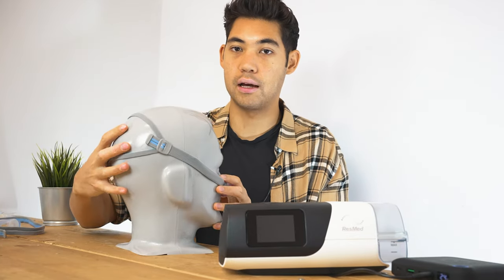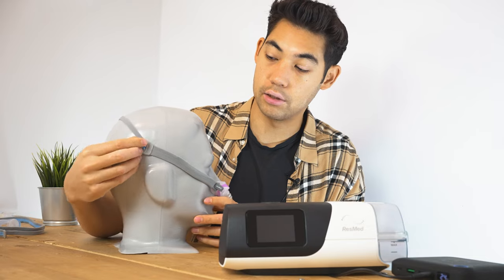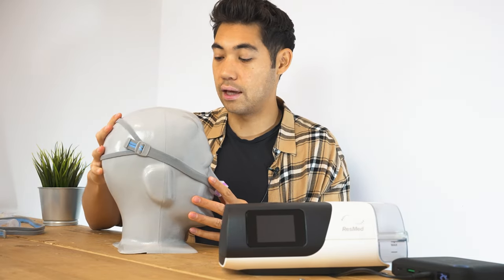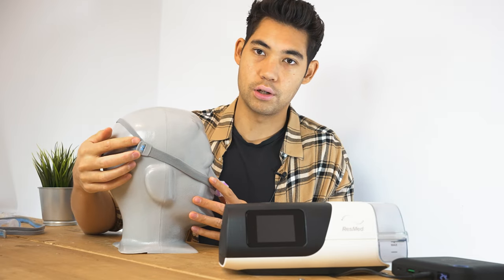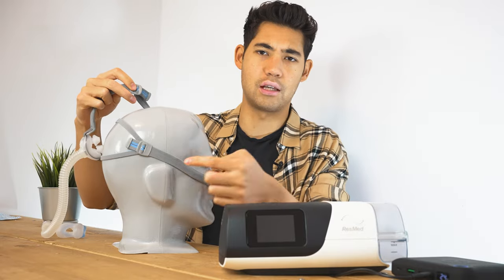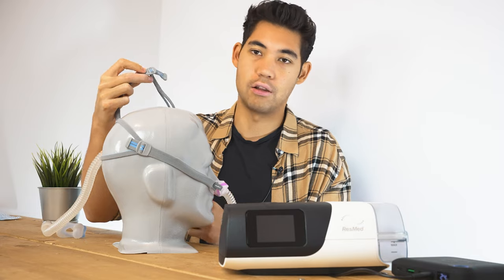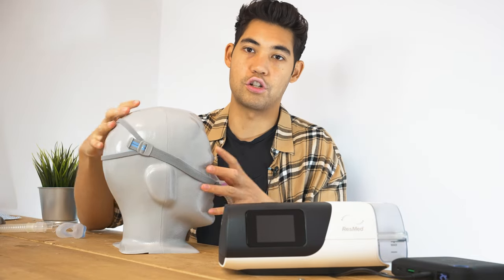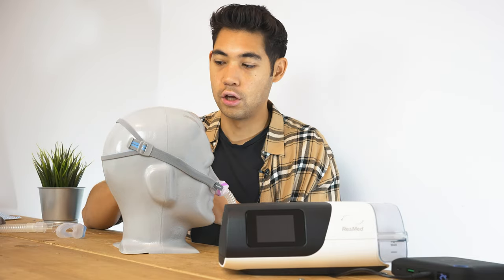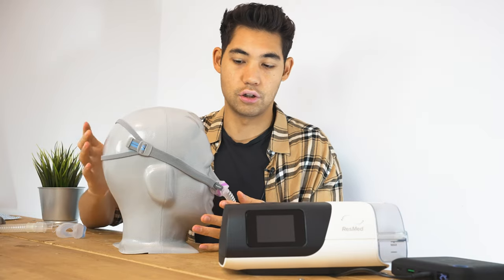Looking at the mask, we have the headgear in the back — it splays out on the back of the head. We have this adjustment band right here, and this can adjust the tightness of the headgear. The older masks didn't have this, but the P10 now has it as well. The older masks would stretch out over time and be too loose on the head, whereas with this, even if it does stretch out, you can just tighten this band and you're good to go.